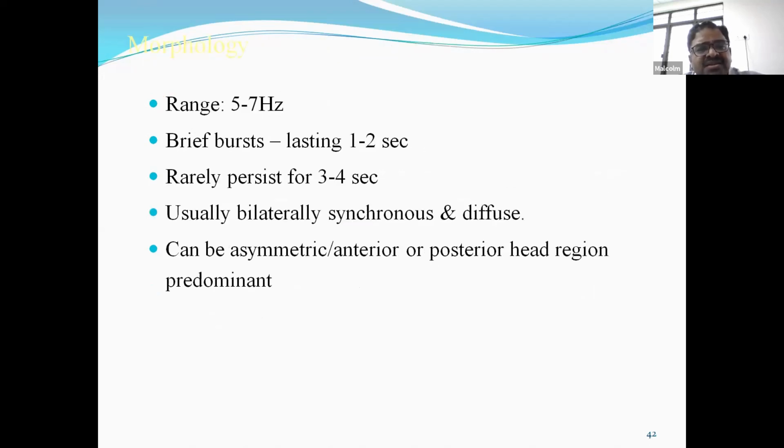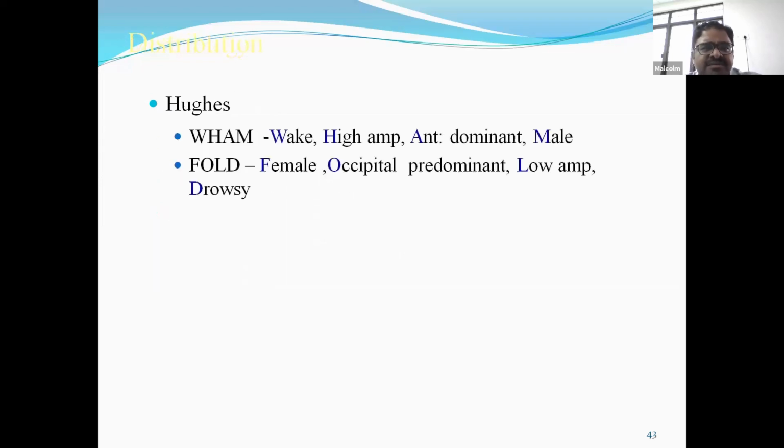The range is 5 to 7 hertz. The burst could last for 1 to 2 seconds. It rarely persists for 3 to 4 seconds. It's usually bilateral, synchronous, and diffuse. It can be asymmetric, anterior or posterior head region dominant as per the gender.